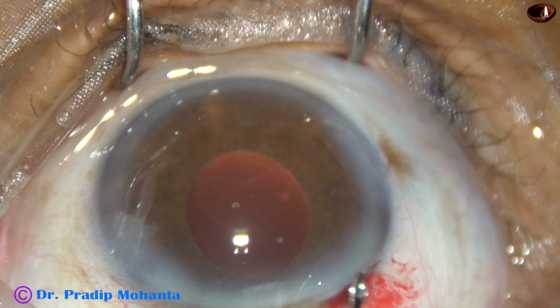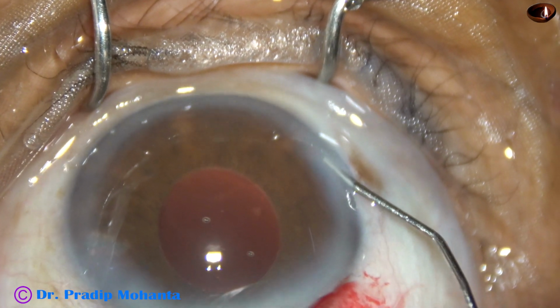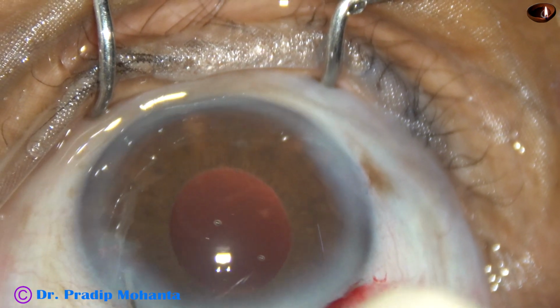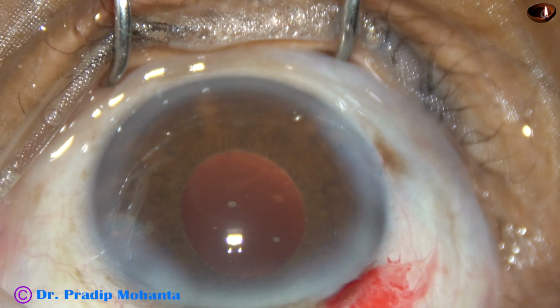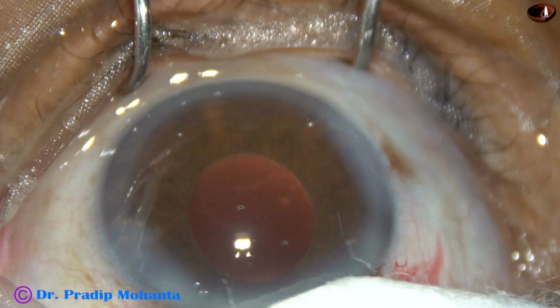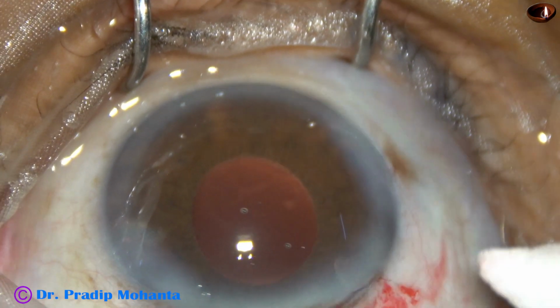And now, after hydrating the side ports, this is the last step of the surgery. I am injecting a bit of moxifloxacin in the anterior chamber. About 0.05 ml of undiluted moxifloxacin has been injected into the anterior chamber. The integrity of the wounds is checked and the case is concluded.